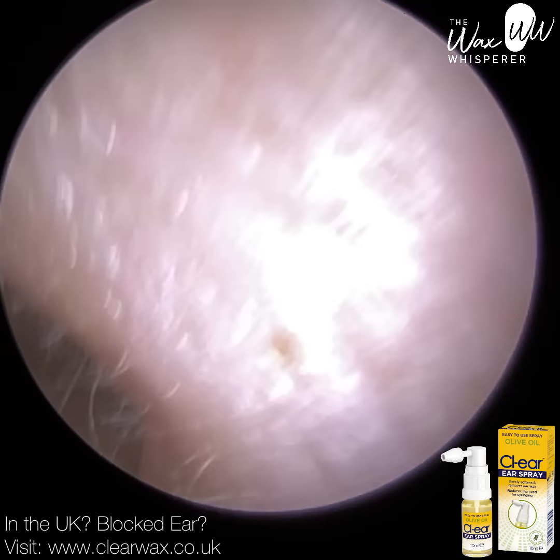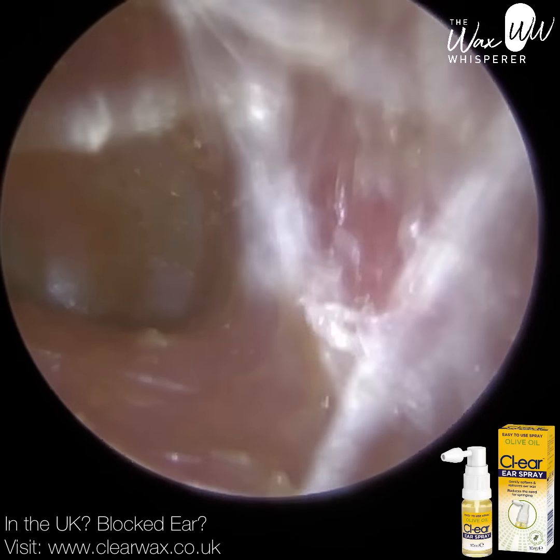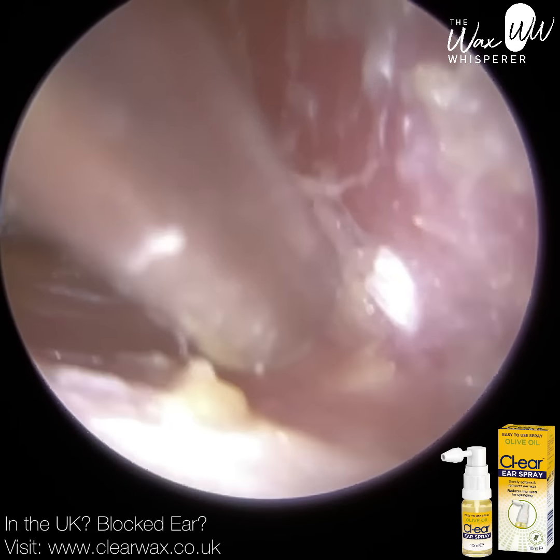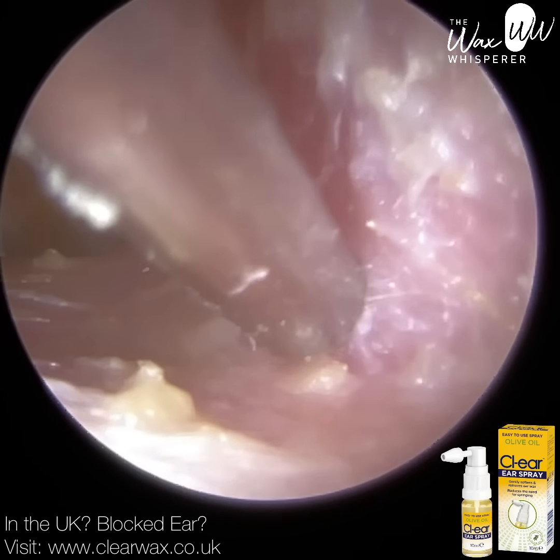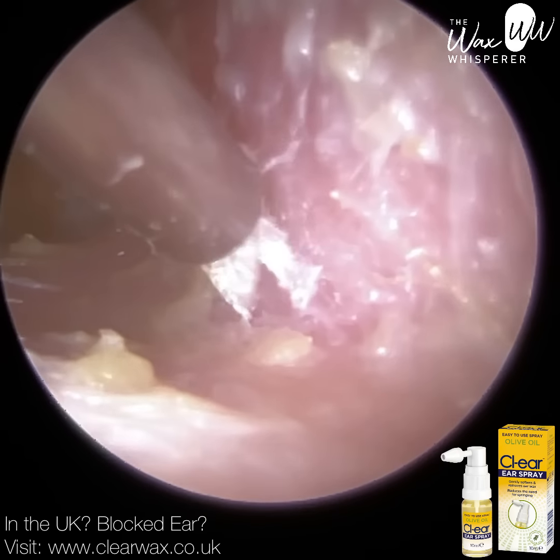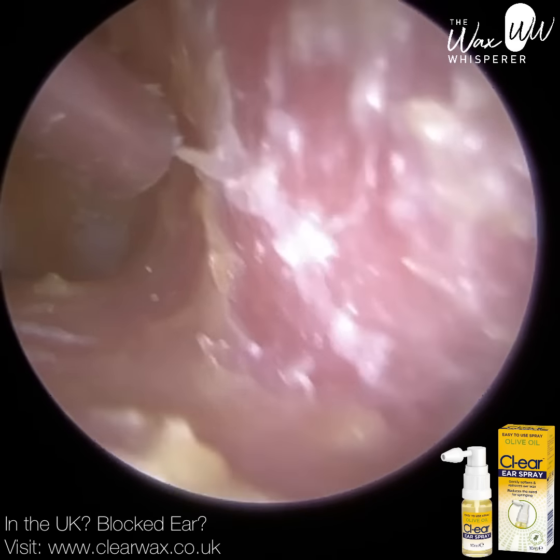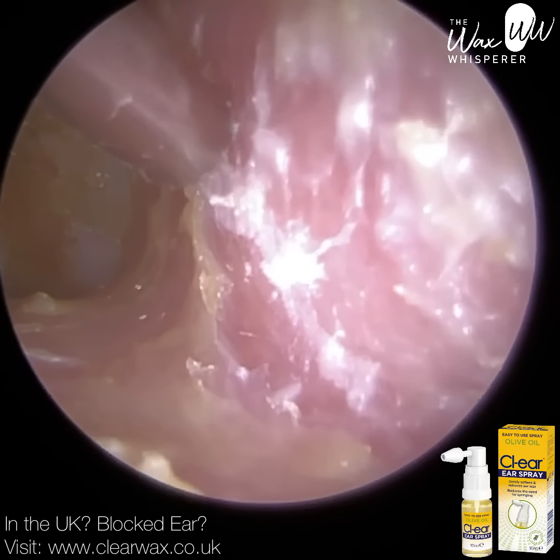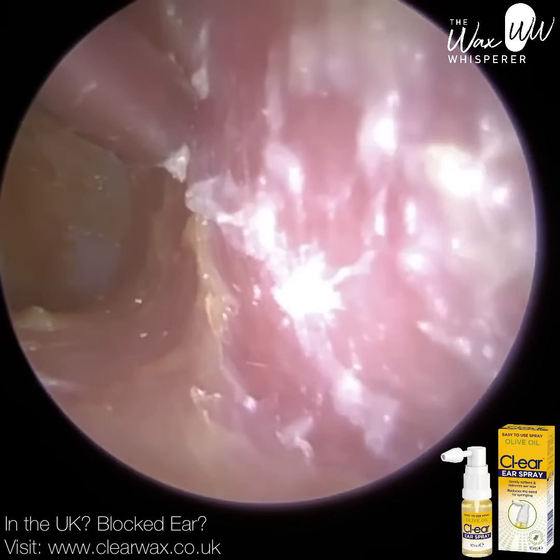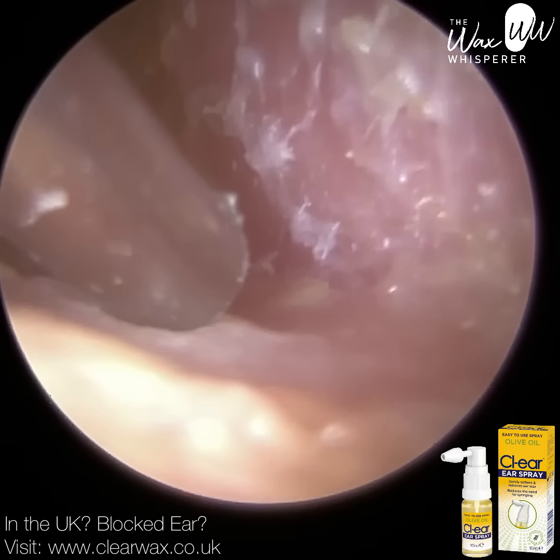Now, the skin has evolved in our ears to shed and come out of the ear as it dies and migrates. If you've got a bit of dead skin on your arm, for example, as it dies, it will naturally shed and fall away from your body into your surroundings. That could be when you're having a shower or through any friction or physical movement. Even the simple act of putting your clothes on will rub the skin and any dead skin will fall away.